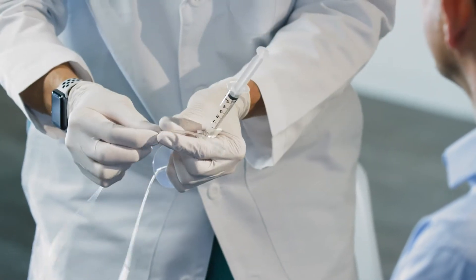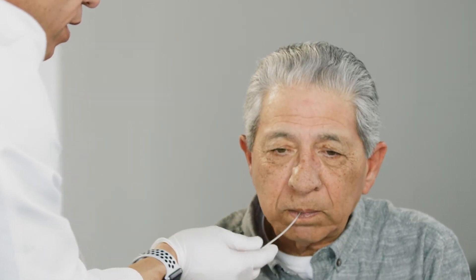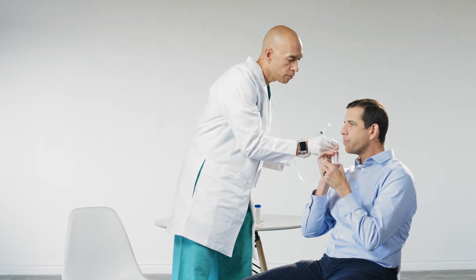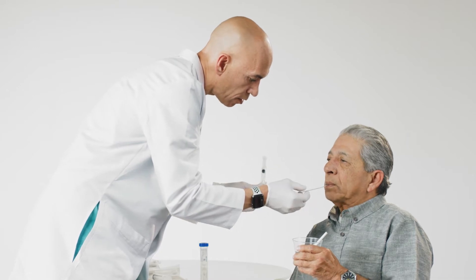Hold the catheter 5 to 10 cm back from the capsule and ask the patient to open their mouth. Place the capsule towards the back of the tongue into the posterior oropharynx. Have the patient close their mouth and swallow to initiate transport of the capsule into the esophagus. A sip of water may be necessary. As the patient swallows the capsule, advance the catheter into the patient's mouth to ensure there is no restriction and the catheter is free to follow along as the patient swallows the capsule into the stomach.